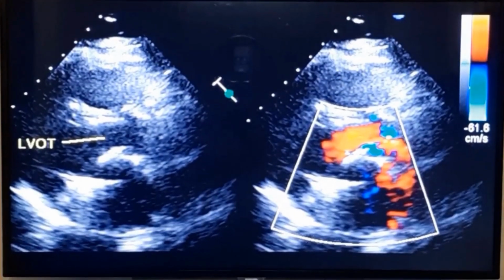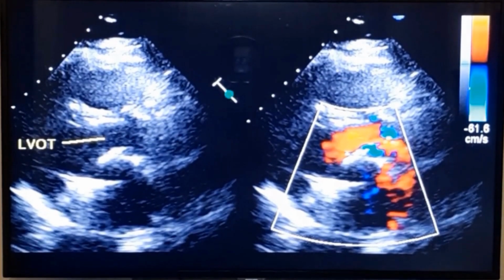This is an echocardiogram from a normally functioning mechanical prosthetic mitral valve. It is very important to have serial recordings in case of prosthetic mitral valve because normal gradients across prosthetic valves are different for different types of valves and also for different locations. Gradient will be higher at aortic location compared to mitral location.